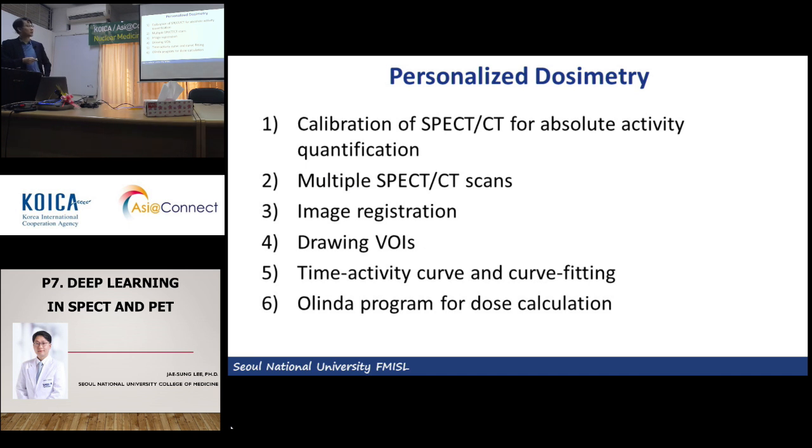First, we should calibrate SPECT/CT for the absolute activity quantification, and then we should obtain multiple SPECT/CT data for the calculation of the cumulative activity.